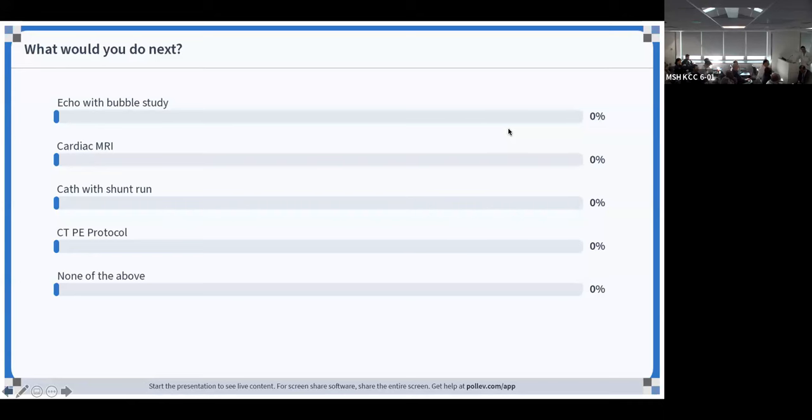I didn't see that much right ventricular hypertrophy. So, if we do have some elevated right ventricular pressures from an increased pulmonary flow, that might happen, but we don't see that much right ventricular hypertrophy. The other thing we look at is if there is volume overload, where is that volume overload? So we're looking at the atrial septum, we're looking at the pulmonary veins, and we're looking at the coronary sinus as well.